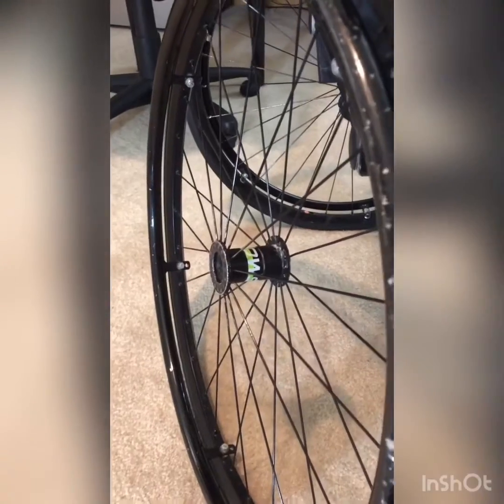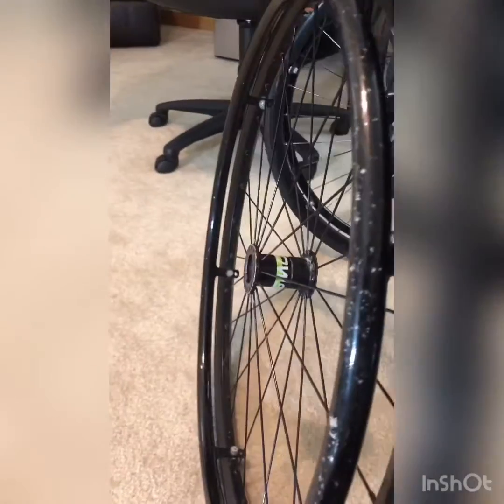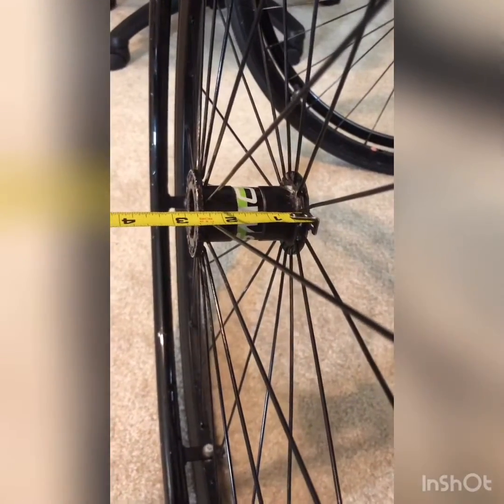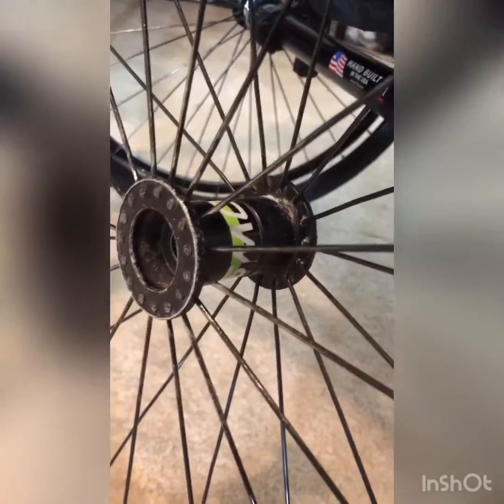Next we're going to look at the wheel — this is either the new wheel you've purchased or the existing wheel. We just need to know the hub width. On many wheels you can simply take your tape measure and measure the width of the hub. However, on some wheels that poses a problem because it has a sunken bearing, so you have to measure from the outer bearing to the outer bearing.